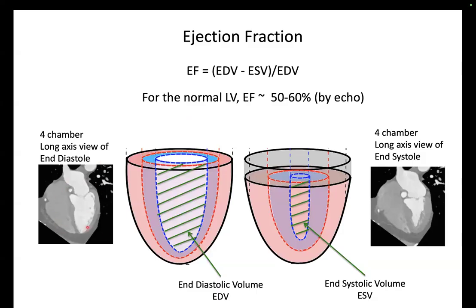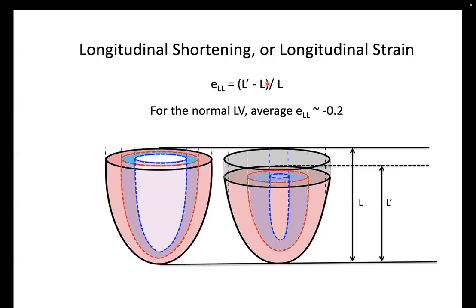So here's our CT at end diastole, one time frame at end systole when this volume is the smallest. We just look at those two volumes and use this ratio as you did. I think you did that on a problem set. And normally you eject at least 50% of the blood in your ventricle, your left ventricle. It can go much higher even when you're under stress or dobutamine or adrenaline or something like that. It can get up to 80%.